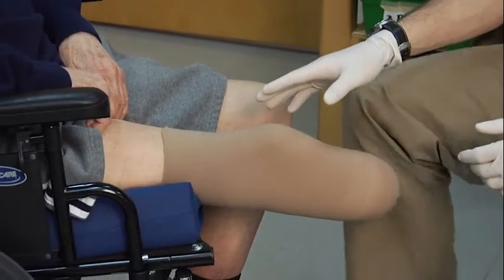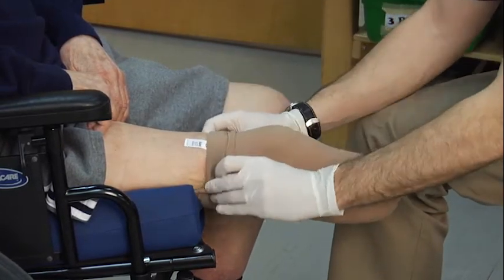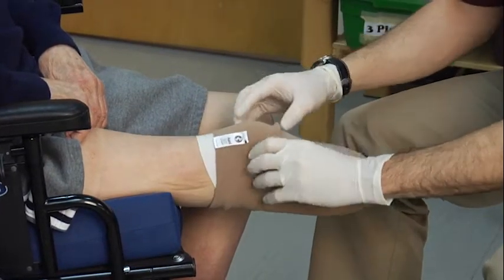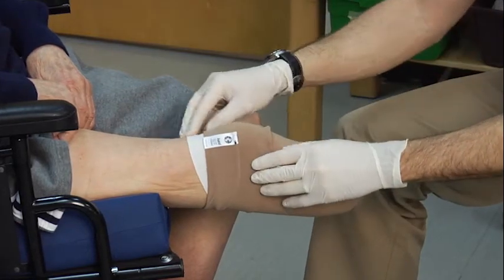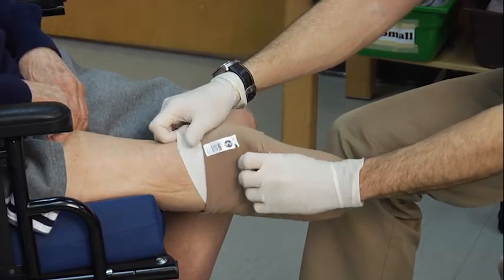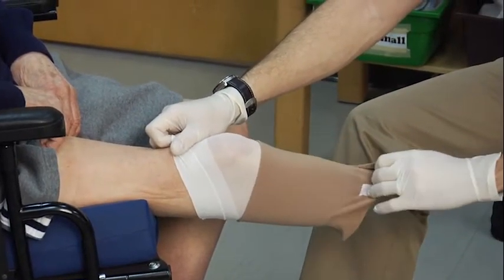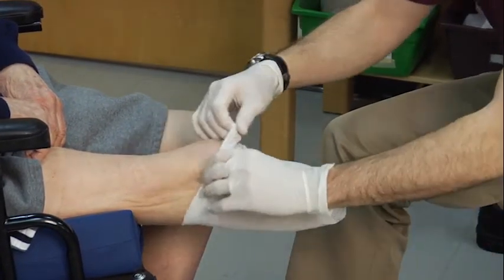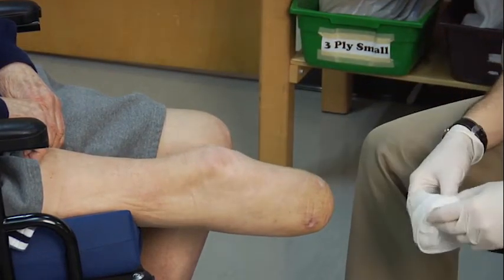I'm now going to show how to remove the shrinker sock with the sheath. In order to make sure that we don't interfere with the dressing on the distal end of the limb, I'm going to roll the shrinker sock down a small ways until the sheath is exposed. I'm then going to grab the sheath with one hand and take the shrinker sock with the other and gently roll the sock down until it comes off. I can then remove the sheath and inspect to ensure that nothing has happened to the limb.